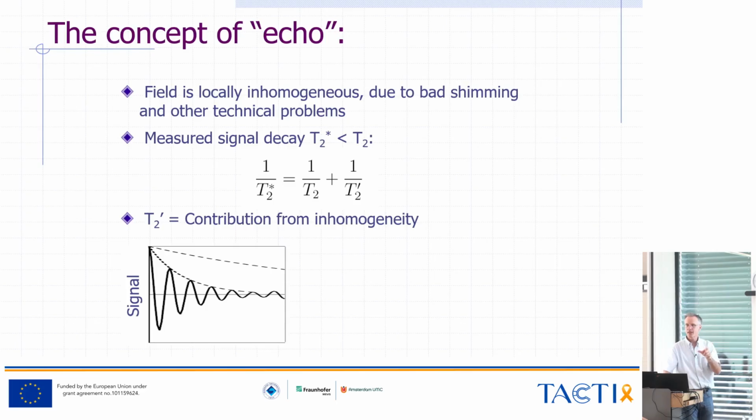And the resulting relaxation time, as I said, is shorter than T2, and it's called T2 star. So if we are just exciting our signal and reading it out with a certain echo time, we are not getting a T2 weighted image, what we wanted to have, but a so-called T2 star weighted image, which reflects field inhomogeneities that can be made use of for functional imaging, but for pure imaging, it often leads to distorted images and poor image quality.